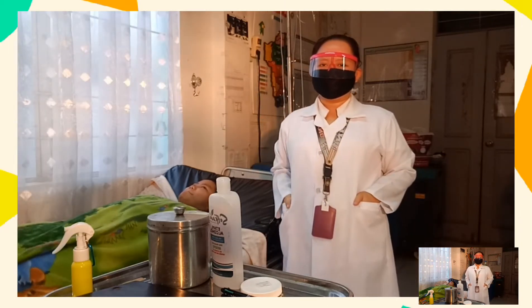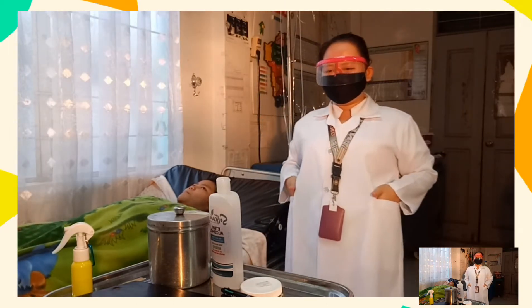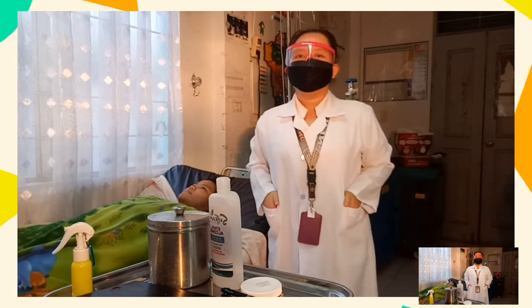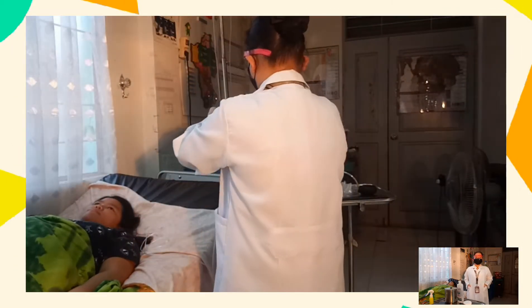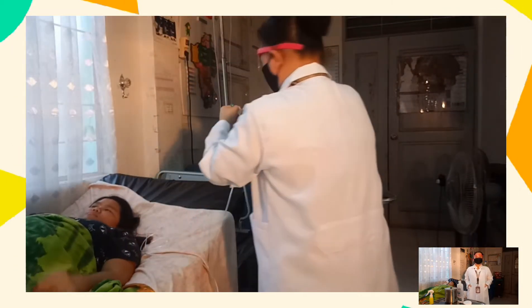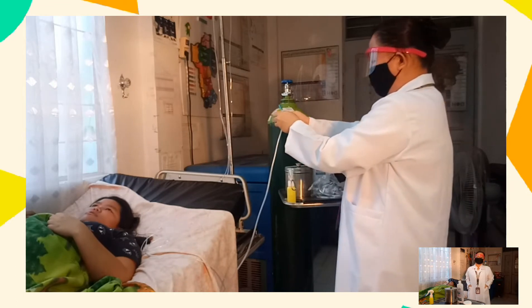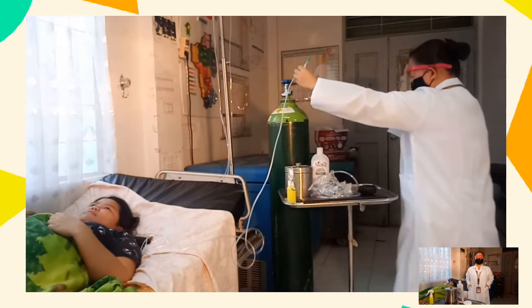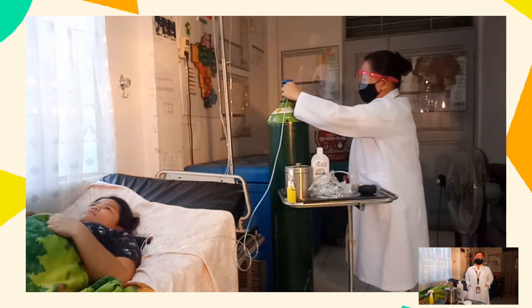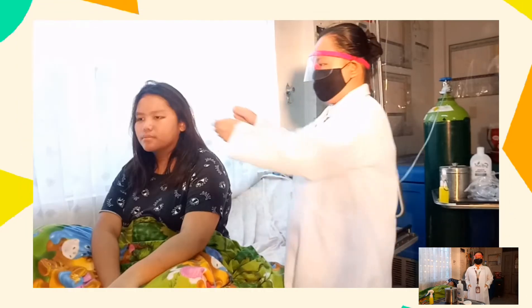Place no smoking signs in appropriate areas. Next, connect the nasal cannula to the oxygen setup with humidification if one is in use. Adjust the flow rate as ordered, then check that oxygen is flowing out of the prongs.